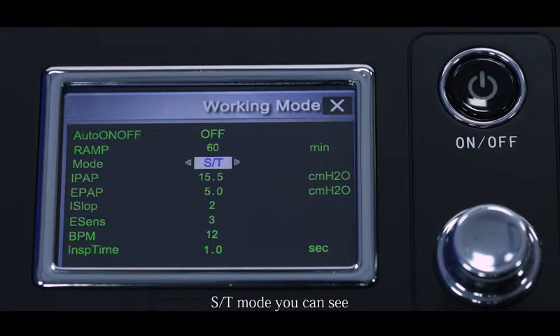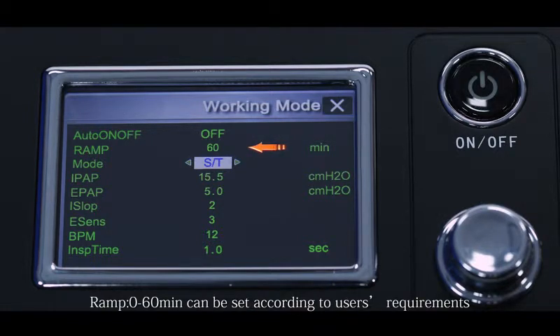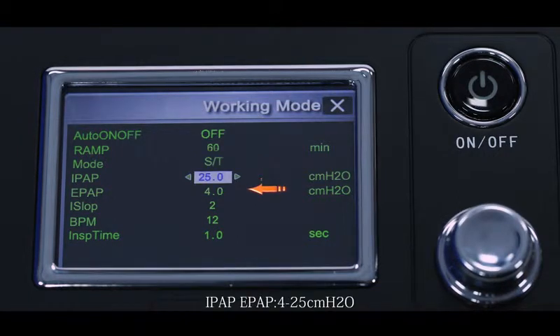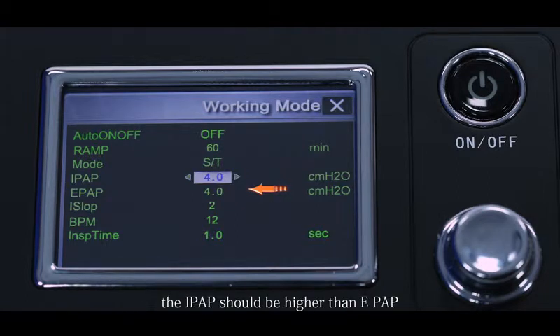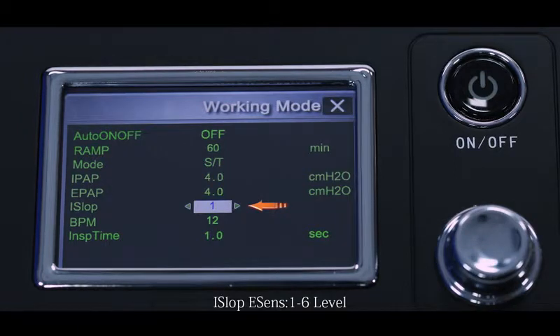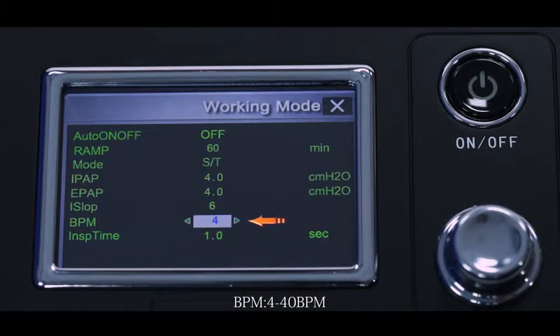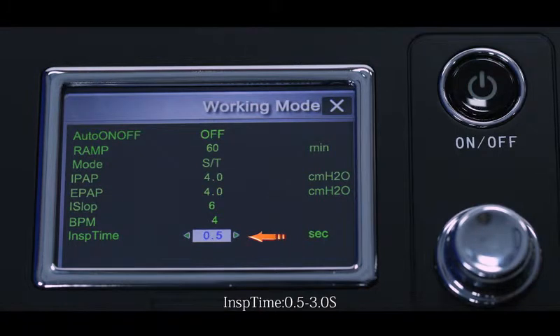ST mode settings: Auto on/off. Ramp: 0 to 60 minutes, set according to user requirements; if not needed, set to 0. IPAP and EPAP: 4 to 25 cmH₂O — IPAP should be higher than EPAP. I-slope. E-sense: 1 to 6 levels — the smaller the value, the higher the sensitivity. BPM: 4 to 40 BPM. Inspiration time: 0.5 to 3.0 seconds.